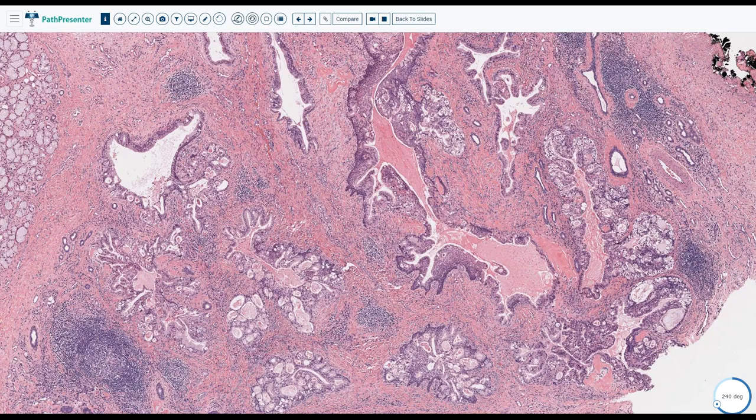Especially on the fine needle aspiration. Actually, if it's a resection, I guess you can be bold and say this is mucocele, with all the histiocytes, positive mucocyte. But if you have fine needle aspiration and get a lot of mucin, you want to be sure, even in a young population, it can be at any age. Okay, all right. So let's see.